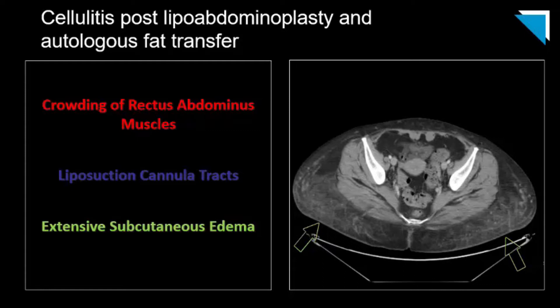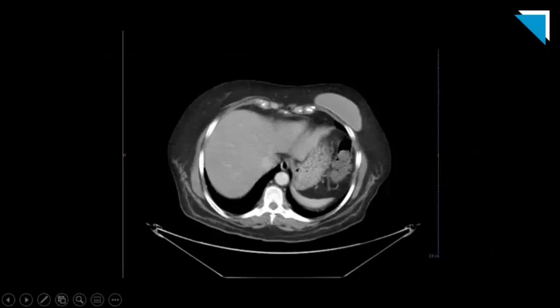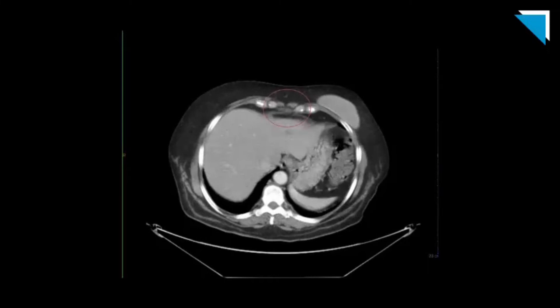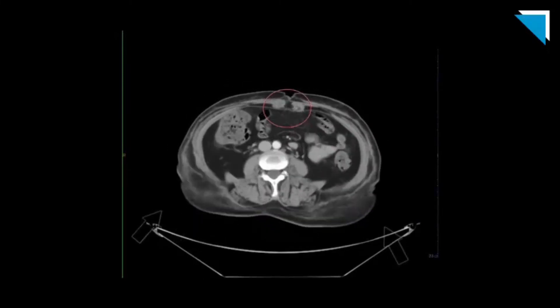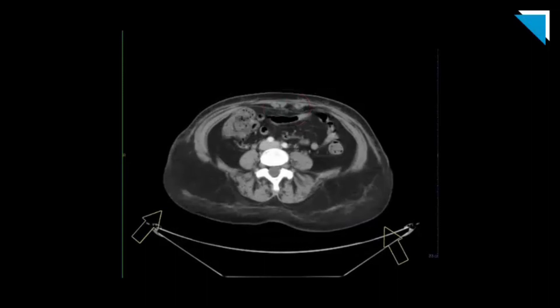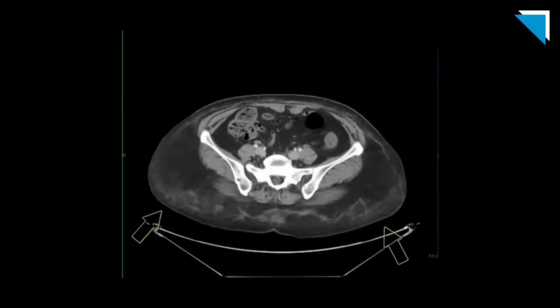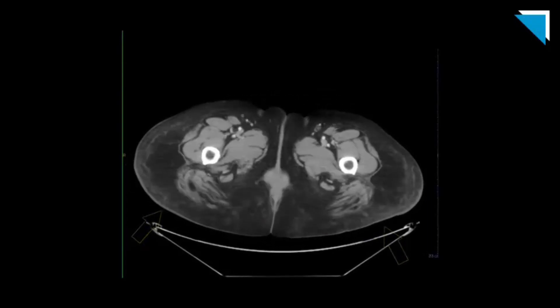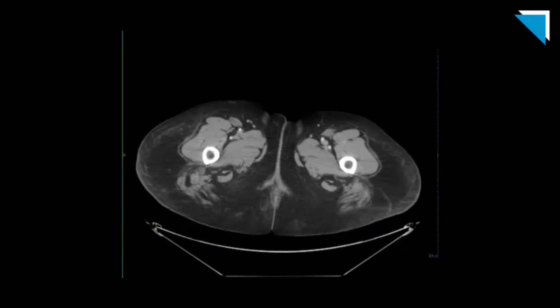The edema and skin thickening are compatible with clinically diagnosed cellulitis. The full axial clip shows evidence of multiple prior procedures, starting with the partially imaged left breast prosthesis, then the abdominoplasty, liposuction cannula tracks, and the edema involving the gluteal fat grafting. There is no fluid collection or soft tissue gas.